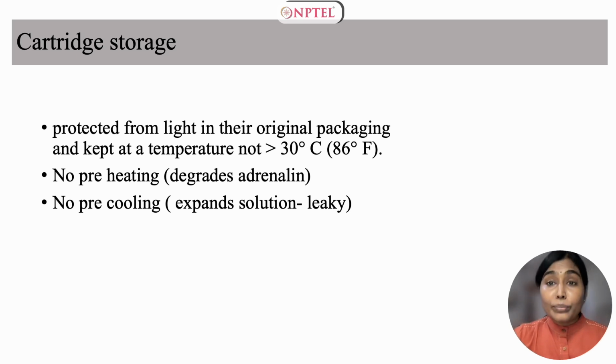Some dentists warm the solution for patient comfort during administration. But remember, heating the solution may cause discomfort and faster degradation of the vasoconstrictor epinephrine. Various studies have shown that heating the solution to 27 degrees centigrade or higher can cause patients to feel burning during administration. In addition, the degradation of epinephrine shortens the duration of anesthetic effect, which may cause even more discomfort for the patient.